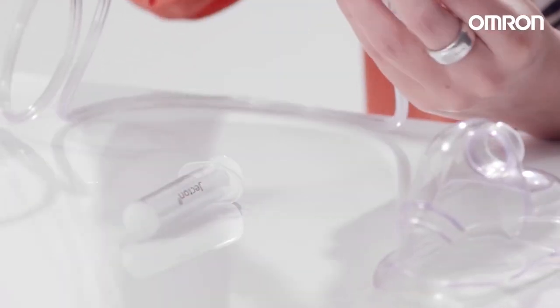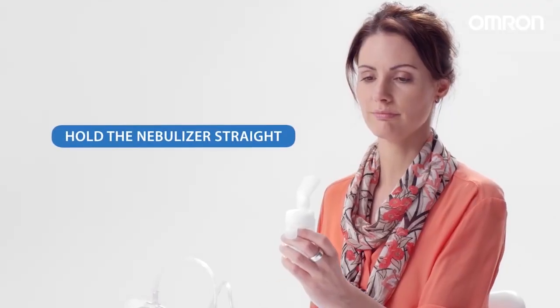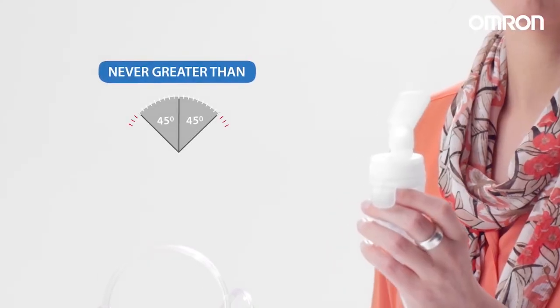Attach the cap, mask, or mouthpiece to the nebulizer kit and attach the air tube. Hold the nebulizer level and do not tilt the nebulizer kit more than 45 degrees in any direction.